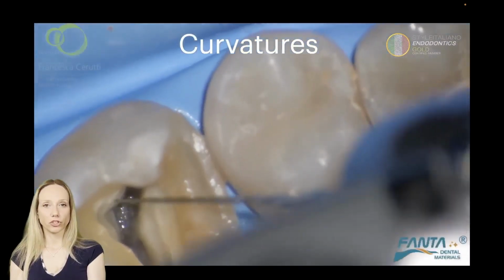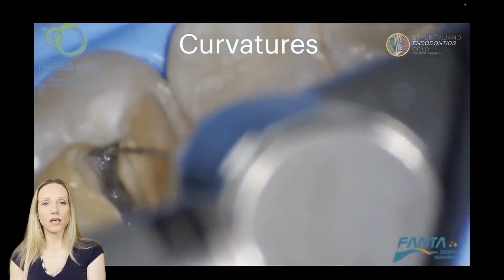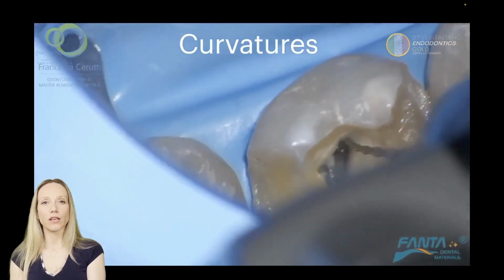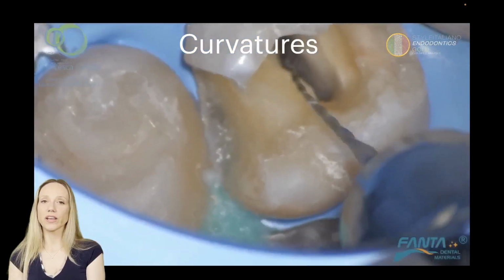When you have curvatures, you can also consider managing them directly with rotary files. The important thing is that you avoid applying any kind of pressure to the file. You do not have to force it into the canal, otherwise it will break or it will create a block.